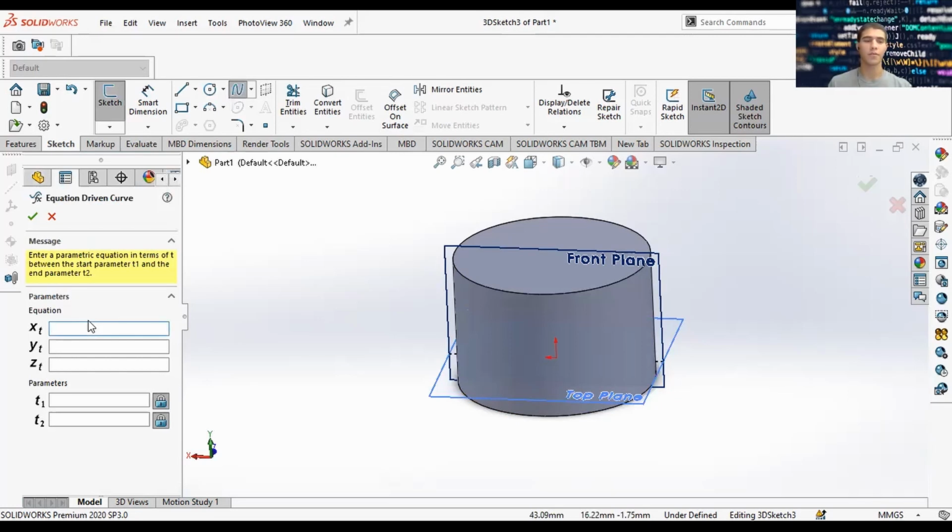And thankfully, I have the notes written here. I figured out the functions needed to get this curve. So let me talk to you a bit about these functions. This is basically going to say on the x-axis, or on the x orientation, make this function. On the y, this is the most important one. You want to have a 2 sine 3t. So the 2 is going to give it the amplitude, and 3t is going to be the number of repetitions if it goes full revolution around the cylinder.